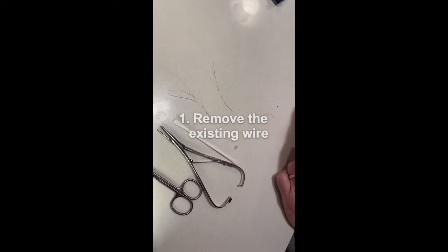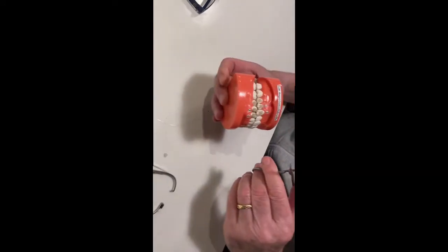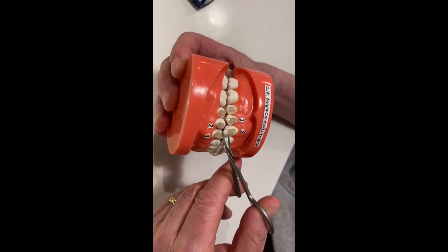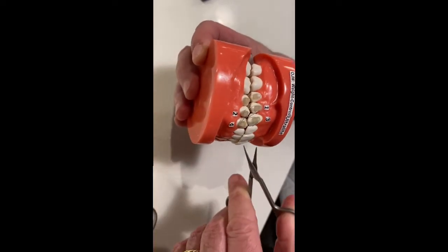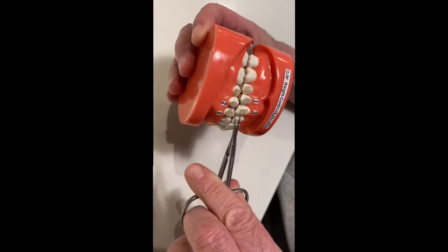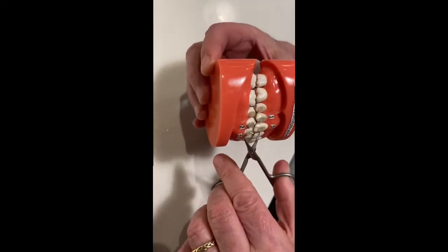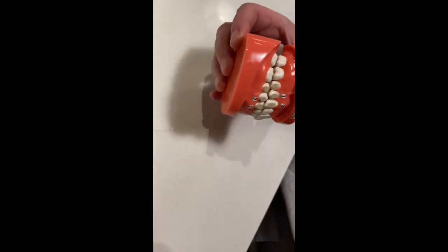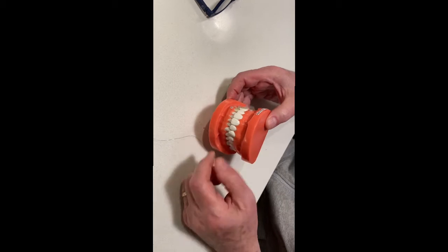Let's do it. First, we're going to remove the wire. It's so simple. It's beyond simple. You just simply cut the wire and then lift it back off. Then you're going to now place the wire.